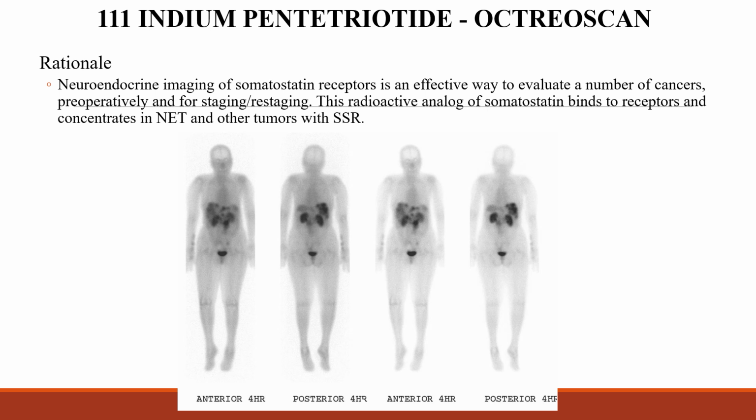The PET doses come by plane, and the pharmacies charge that to the customer when things are being delivered by plane, and so it becomes difficult to get those. And in those cases, Octreoscan is still the way to go. It's a very good drug. As you can see, the image quality just isn't as good just because it's indium and you're using a gamma camera. You don't have all the benefits that you have with PET.